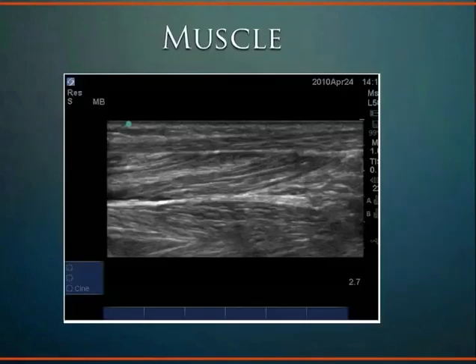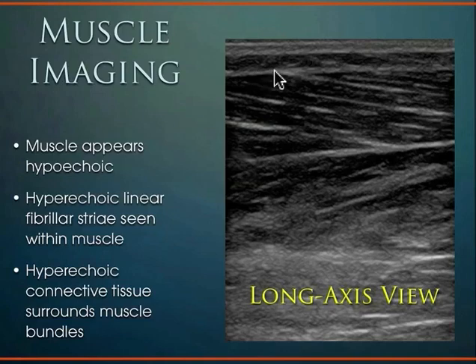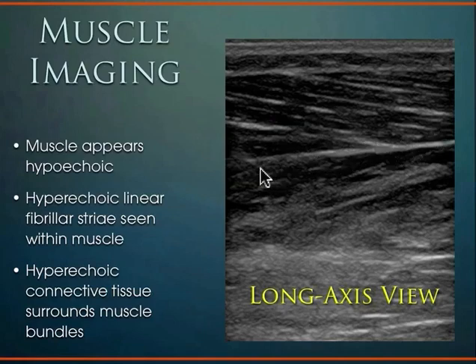Moving to muscle: muscle is another tissue seen very nicely with ultrasound. Muscles tend to be more hypoechoic — not as dense as a tendon or ligament — and have a fibrillar pattern related to interwoven connective tissue within the muscle. On this image: superficial subcutaneous structures, then the connective tissue fascial plane for the muscle, deep to that the fibrillar striated component, another fascial layer, and then deeper muscle structures. You also have that hyperechoic connective tissue with fascial planes clearly visible.